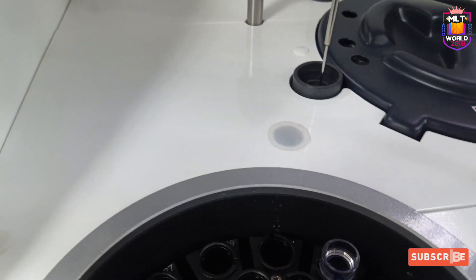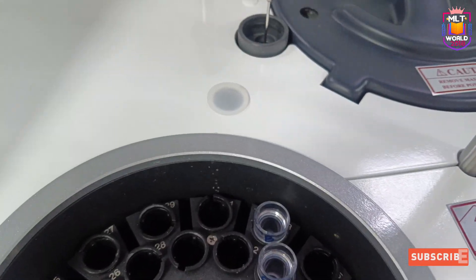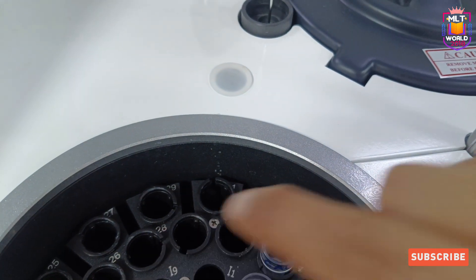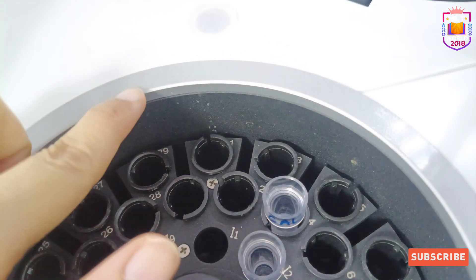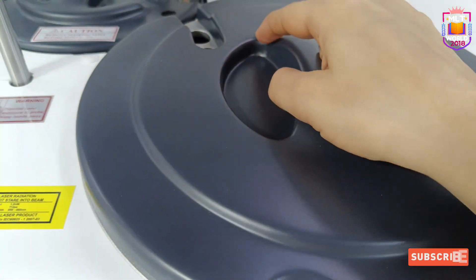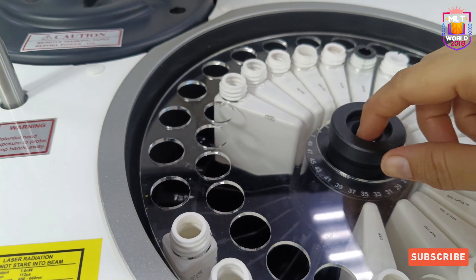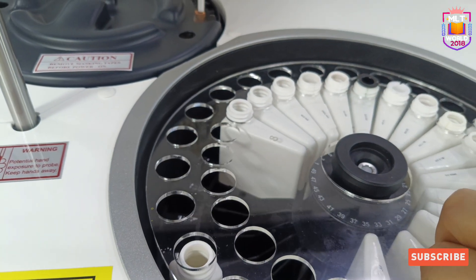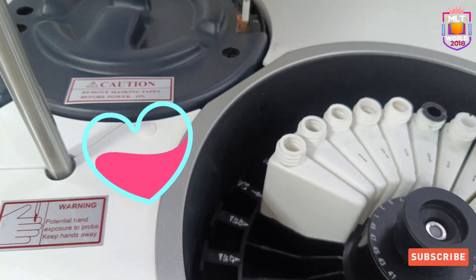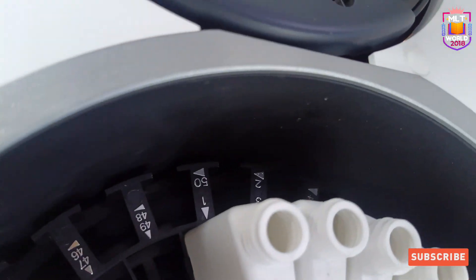First I will make positions 1 and 3 empty in the sample area. This is the sample area — position 1 and position 3. In both positions we will keep AC and AL 200 microlitre reagent. Currently, Excel wash and distilled water reagent are in positions 1 and 3, so we will remove those reagents and keep AC and AL solution according to the assigned message.